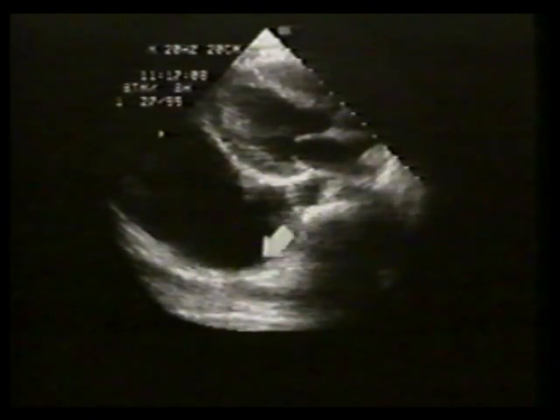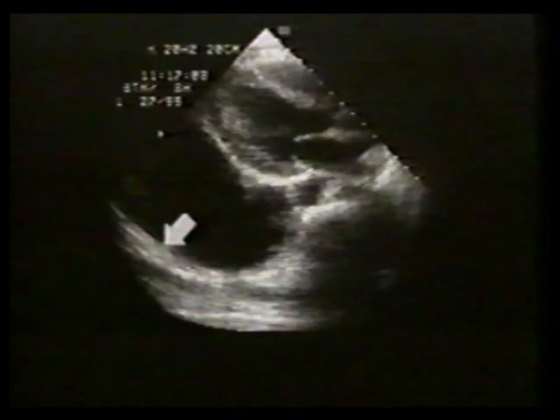Not infrequently, pericardial and pleural effusions may coexist in the same patient, and therefore it is necessary to make the distinction by echocardiography. This patient has a large left pleural effusion. Note that the borders of the effusion do not converge between the aorta and left atrium. Part of the fluid is actually behind the descending aorta. This bright line is the parietal pericardium, while this is the interface of the pleural fluid with lung parenchyma.